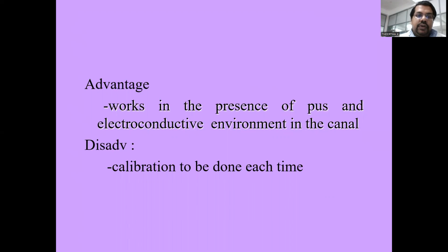Every time you are going to use the apex locator, calibration has to be done, which means it can be a little time consuming.